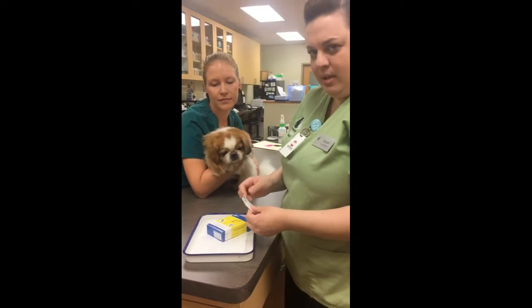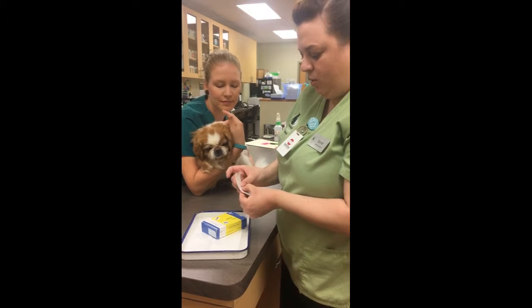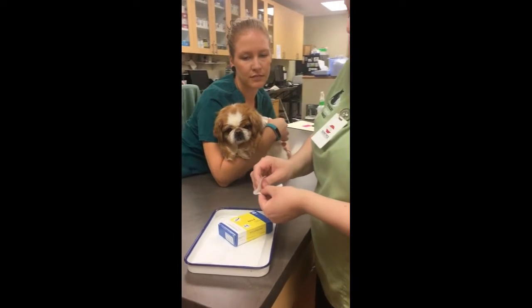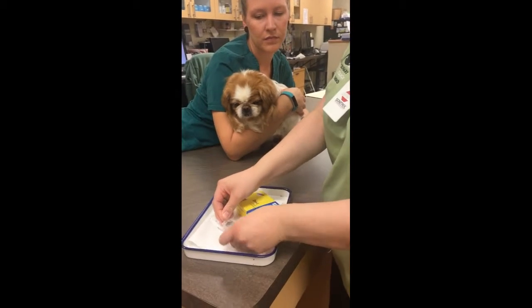We're going to be doing his left eye. It's in our package — it's sterile. While it's in our package, we are going to fold over our notch, and then we're going to open our package without touching anything.